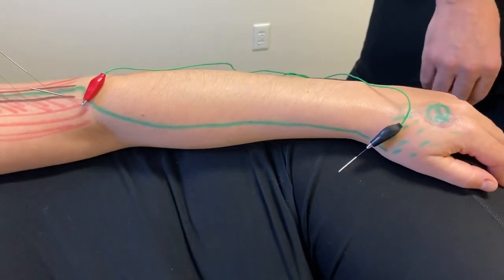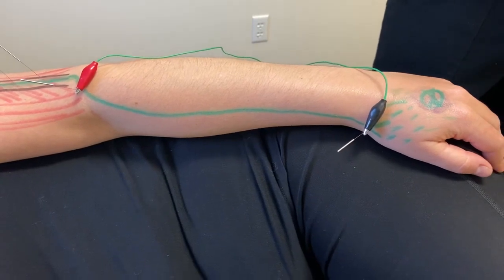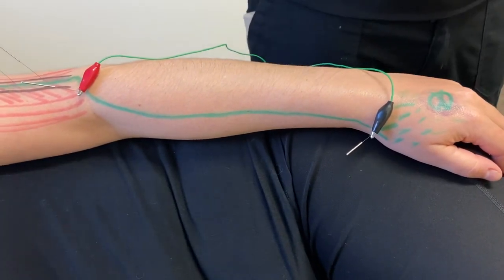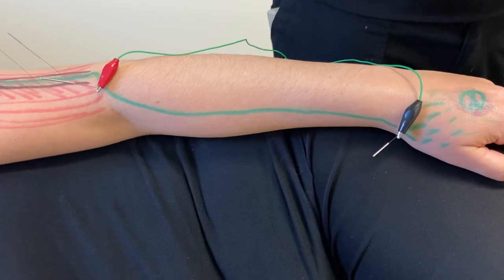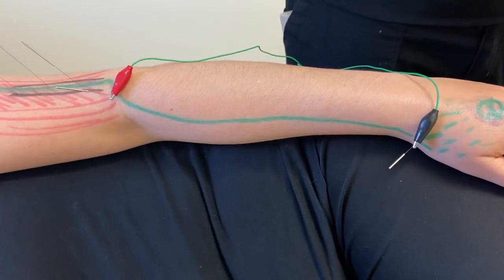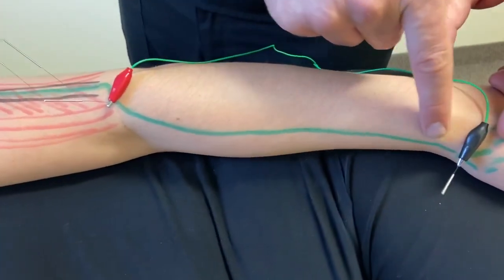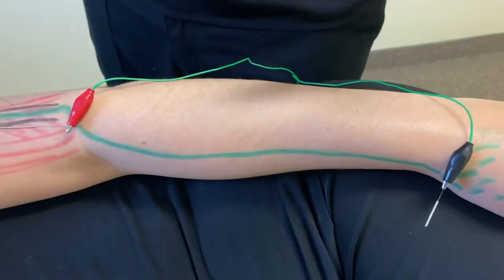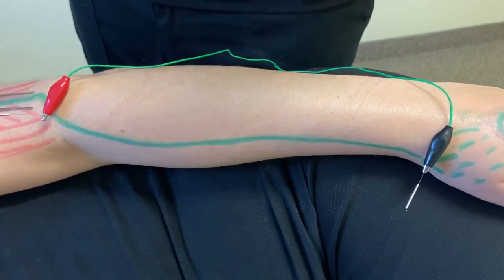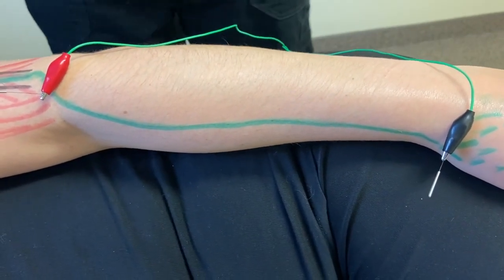And what happens here is sometimes we get a contraction of the motor fibers of the brachioradialis or whatever muscles are in the vicinity. All right. Just let me know when you feel it. You can feel it a little bit. There we go. So you can see here, because we're not in the vicinity of many motor fibers, that's not the intention. What the patient needs to feel is a sensation in this area, a neuromodulation, because we want a non-noxious stimuli to decrease the spinal sensitization at the spine and then locally at the area of the superficial radial nerve. Doing okay? Yeah. Great.